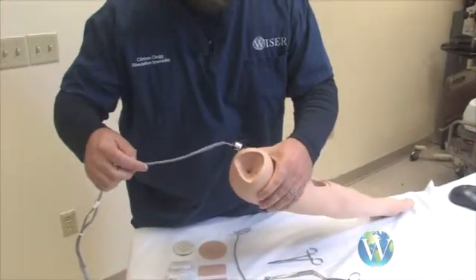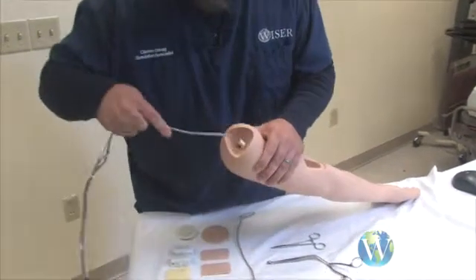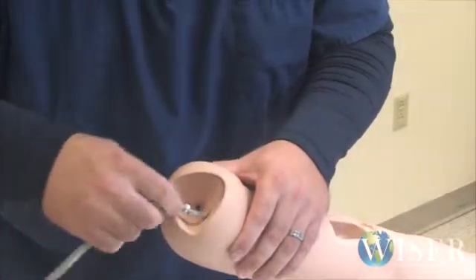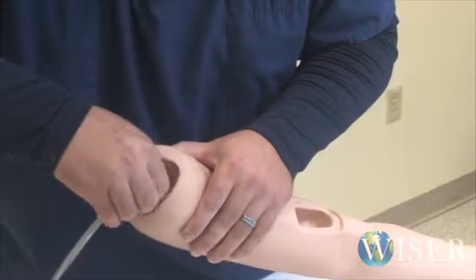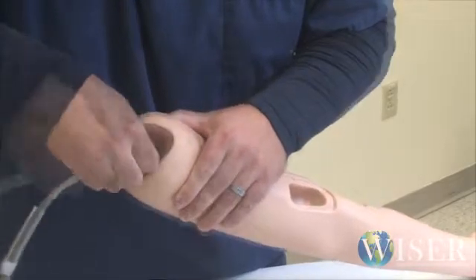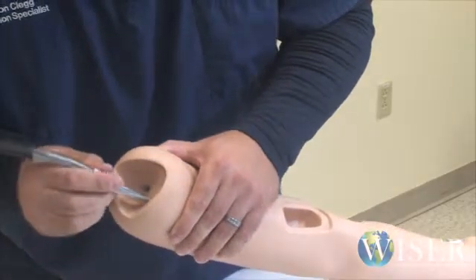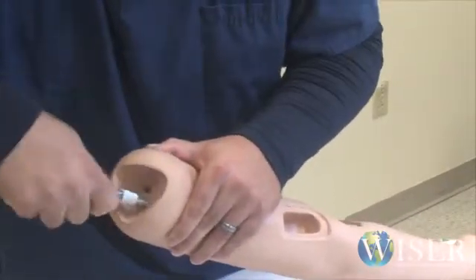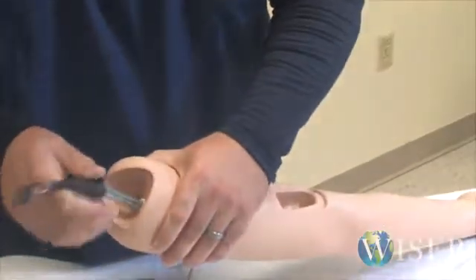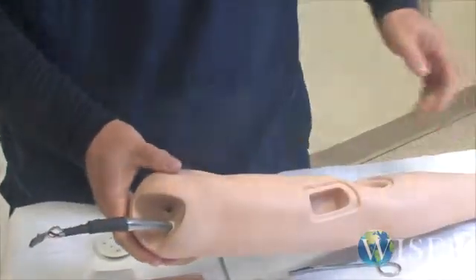Okay, so to reinsert your wire, whether you're replacing it or whatever reason you might have had everything apart, you start at the top, send your first, and this through. And it's tough. You gotta kind of shove them through, but you wanna be gentle because you don't wanna break anything. Once you get all this through, this clear tube, you want to get through as well. Once you get that in, shove it all the way down, about to there, because you still got to run this back through the simulator and get it to its connection inside.